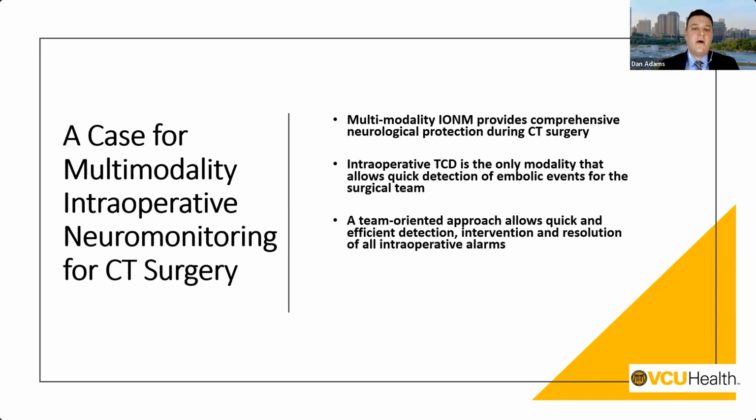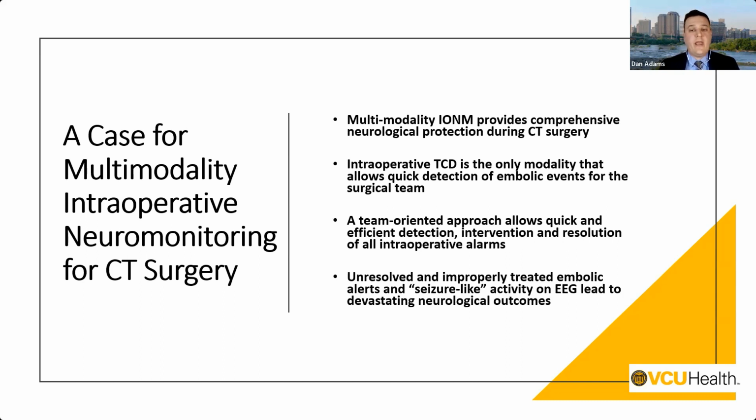And lastly, unresolved and improperly treated embolic alerts and seizure-like activity on EEG, for that matter, can lead to devastating neurological outcomes. Therefore, prompt and timely interventions are crucial.